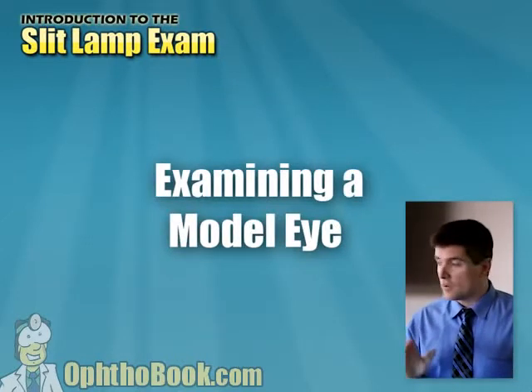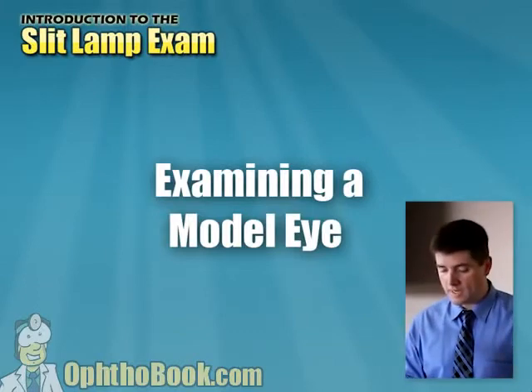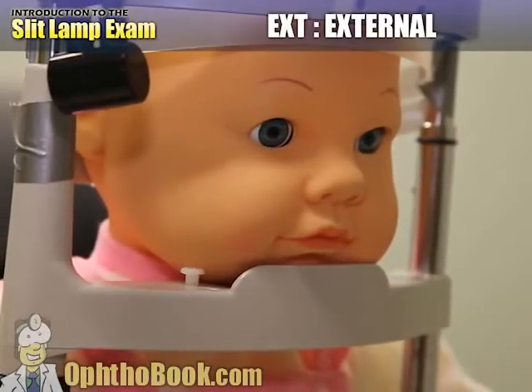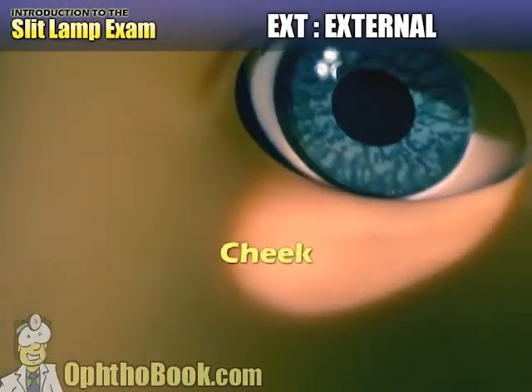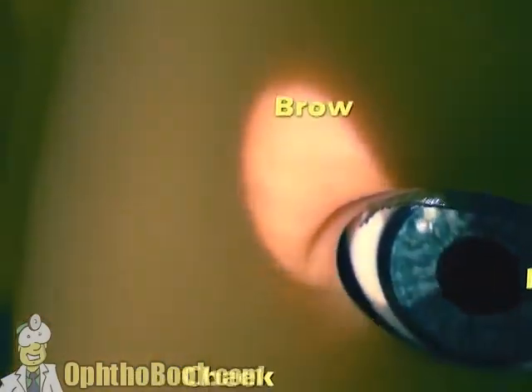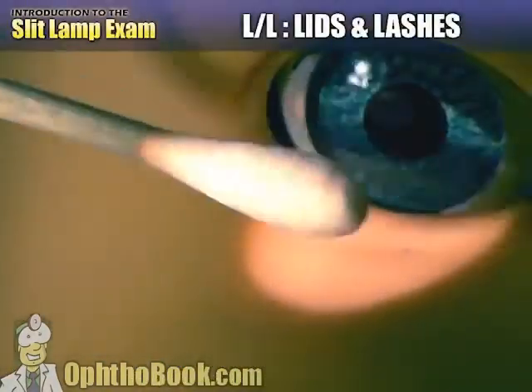these findings, first starting with a model, and then we'll move on to some live patients and we'll look at those findings once again. So we're going to move on to a different model, something that's a little bit more anatomically correct. And we always start with the external eye disease, and we look at the cheek, we look at the nose, we look at the brow, things around the eye that might cause ocular problems or be related.